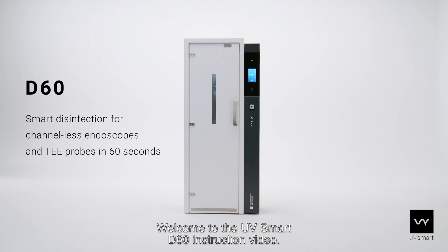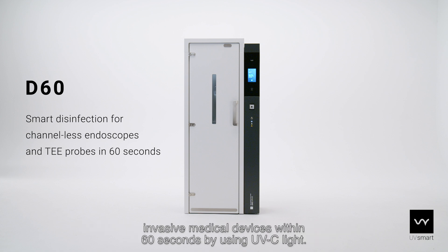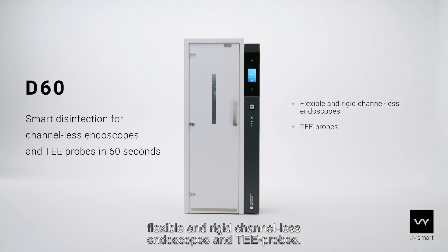Welcome to the UV Smart D60 instruction video. The UV Smart D60 is intended to reduce microorganisms on all external surfaces of channelless invasive medical devices within 60 seconds by using UV-C light. The following medical devices can be disinfected with the D60: flexible and rigid channelless endoscopes and TEE probes.